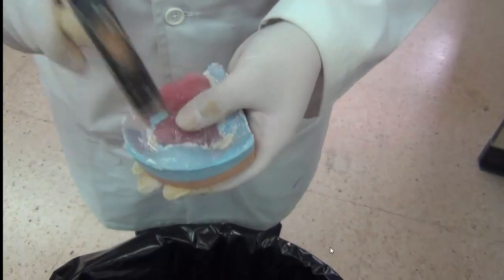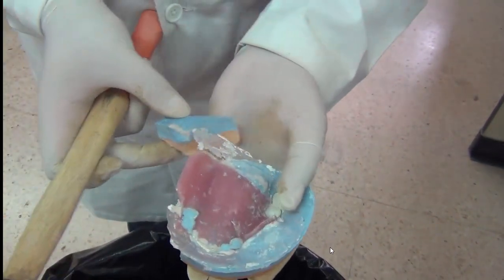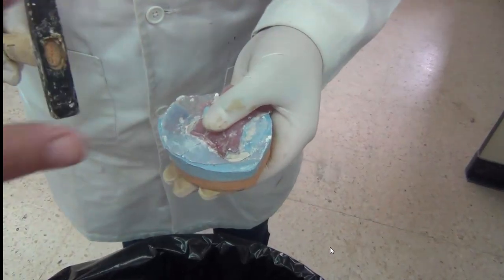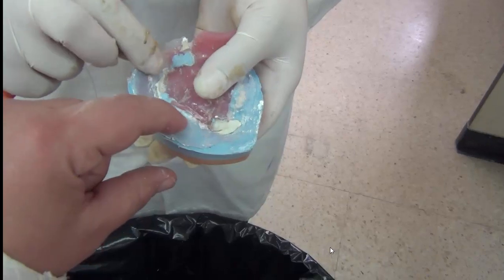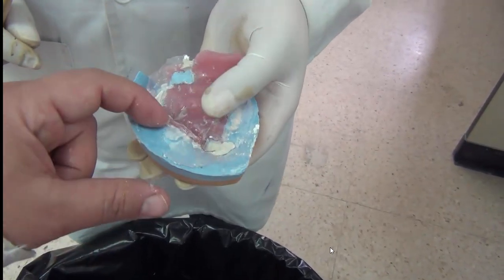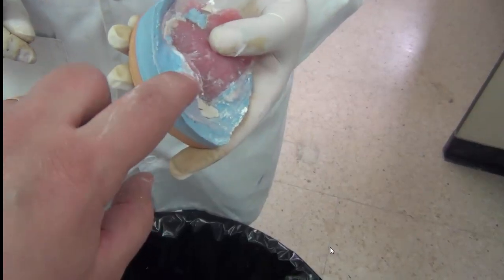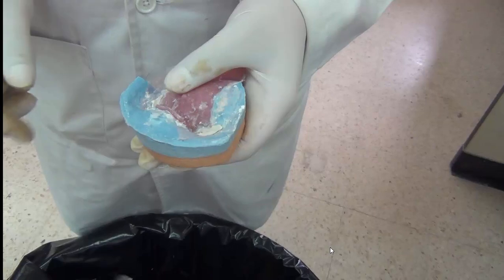Once more on the edges. The whole denture is inside the hand of the technician. And because of the impact strength, it's not the impact strength, actually acrylic has a very low impact strength, but because we are controlling our pressure and our knocking only on the stone side, and this stone has a vertical relation and is already not that bonded to the second layer, it's easier for it to fracture rather than fracturing the denture. So this is using controlled forces.